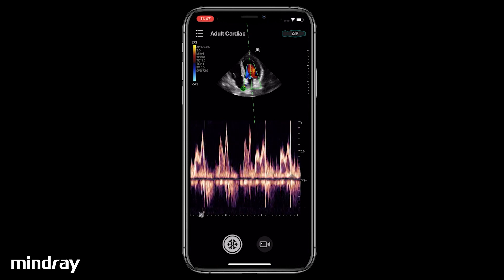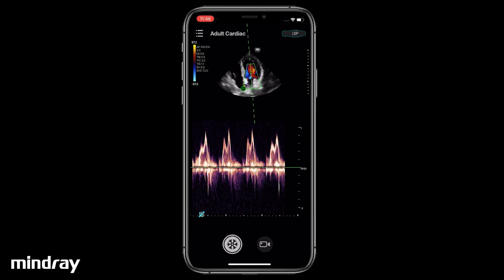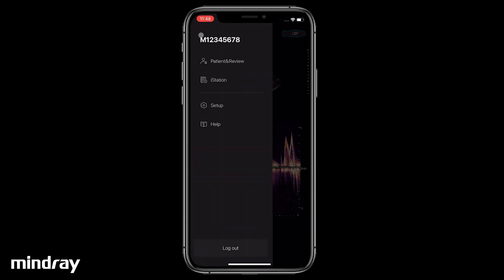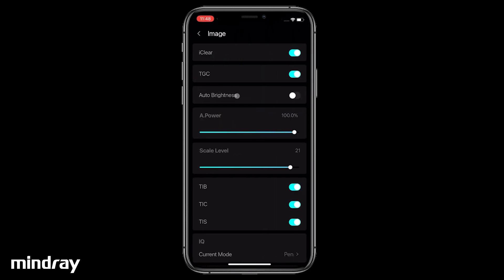Tap the iTouch icon for automatic image optimization if you are unsatisfied with the manual adjustment. Tap the System Tools button, then Setup, and Image for more parameters. Select a proper sweep speed.